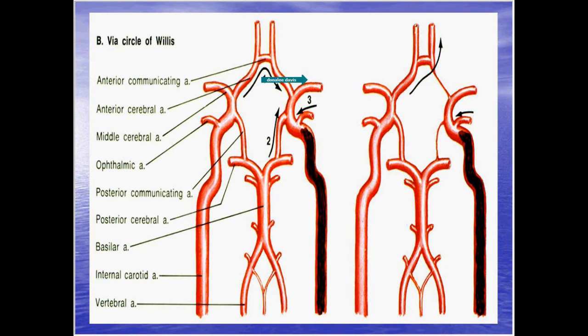have a stroke. And this is why, how many times have you done carotids on people who are pre-open heart surgery? You do a carotid artery for a pre-op evaluation and you find a carotid occlusion and you ask, did you ever have a stroke? And they say, no, I was dizzy that day, but that's about it. That's because these patients have so much protection because both bridges had to be open, or they had a whole lot of collateral through the anterior and posterior. Now this person has the ACOM there, but because their A1 segment's hypoplastic, the flows are just going out the second segment here. This patient has a PCOM that's very, very hypoplastic. This happens in about 30% of people, so it's not uncommon.